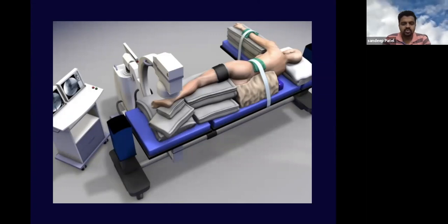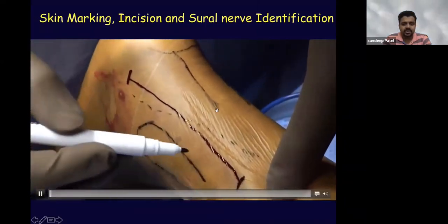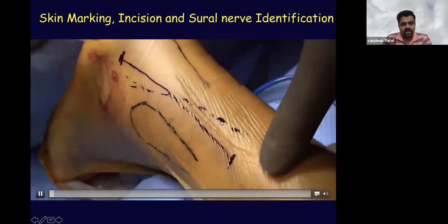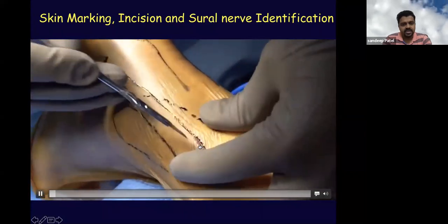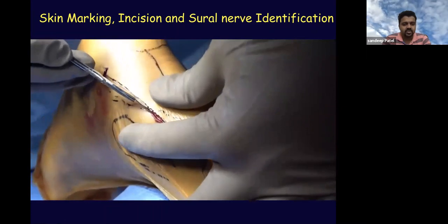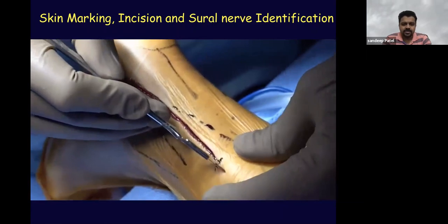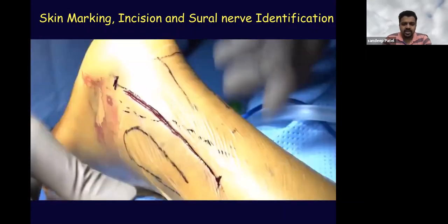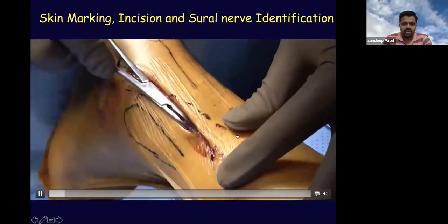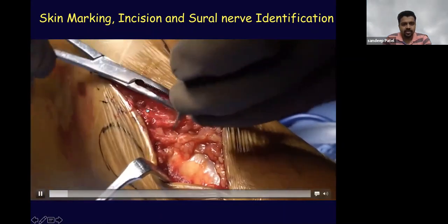For skin marking: the fibula is marked, the tendo achilles, and the sural nerve, which goes all the way across. This is the skin incision — I use a number 15 blade for my foot and ankle surgeries, as it gives good control over the depth of incision in the subcutaneous plane. We get the sural nerve — there are a lot of variations. The usual variant is that proximally it is medial, and as we go distally the nerve crosses the operative field.